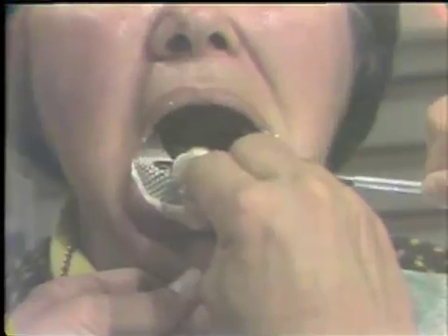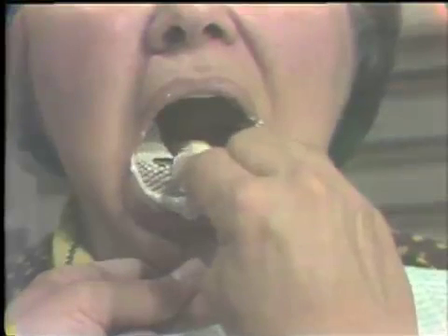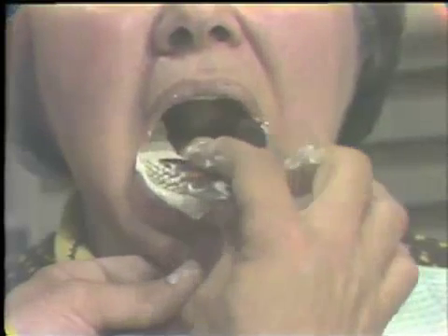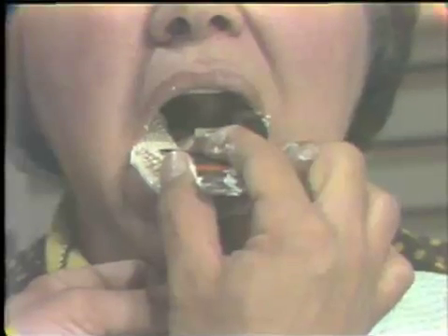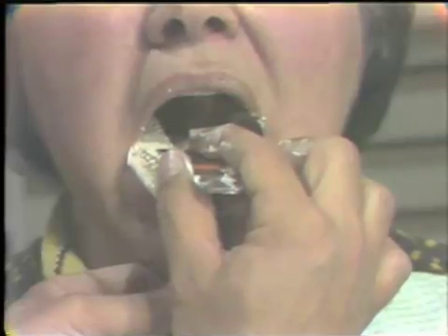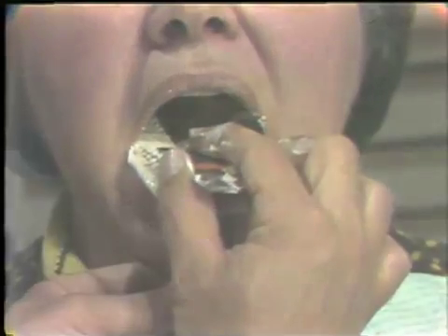As the tray is inserted, you should instruct the patient to raise the tongue, then lower the tongue. The material is allowed to set for the full four minutes. The maxillary impression should be secured in a similar fashion.